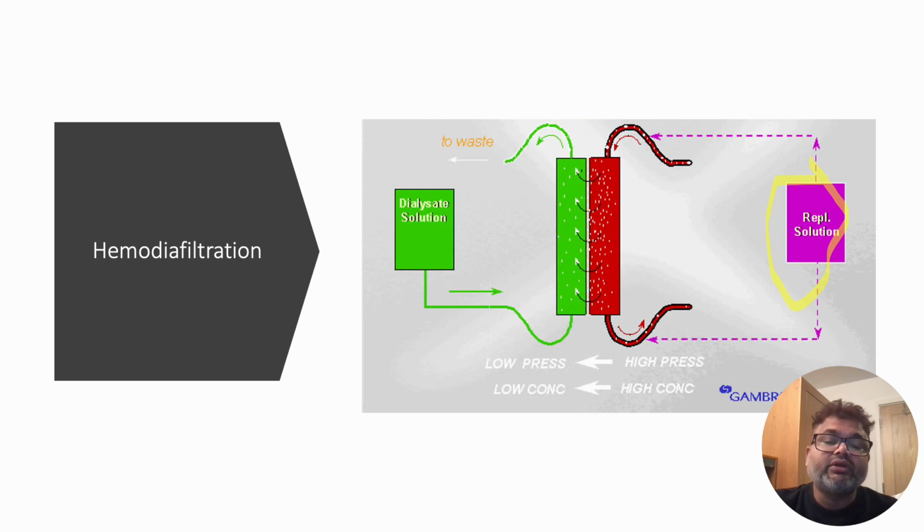Here we put some replacement fluid, and we will also make a flow of dialysate in a counter current route. So both mechanisms will work.